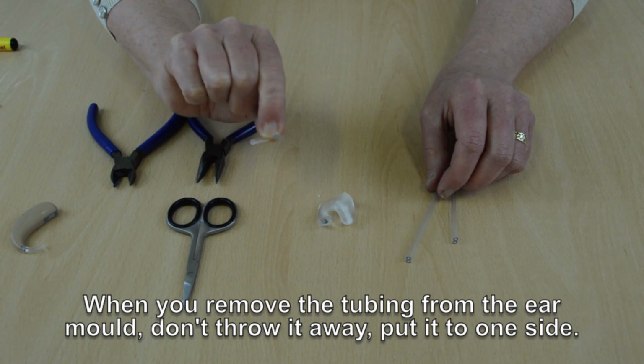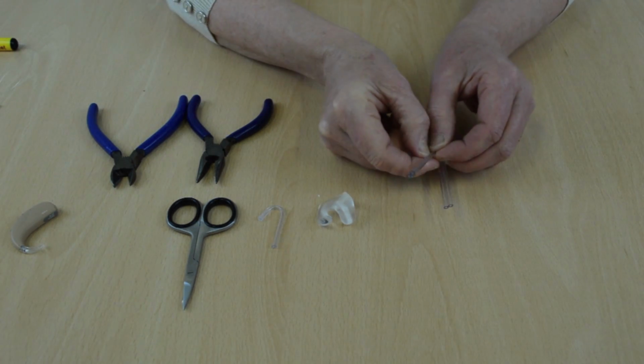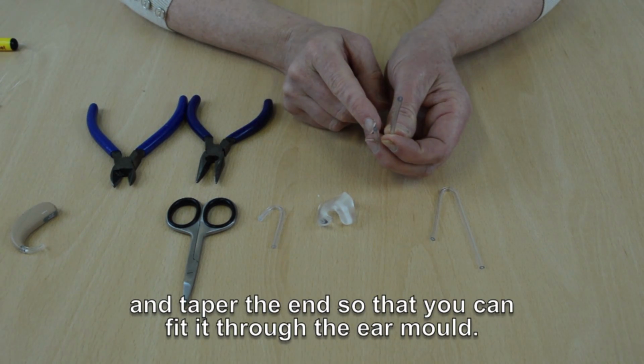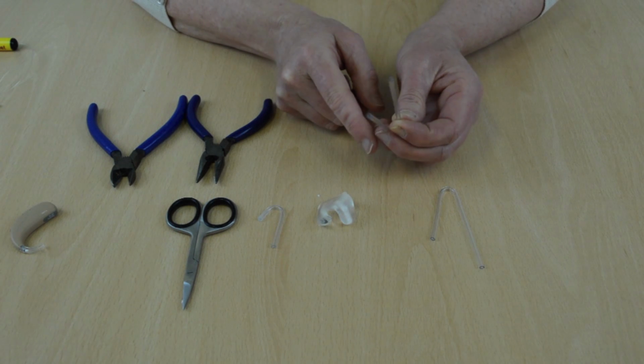When you remove the tubing from the ear mould, don't throw it away, just place it to one side. What you need to do then is take a new piece of tubing and taper the end of the tubing to fit it through the ear mould.